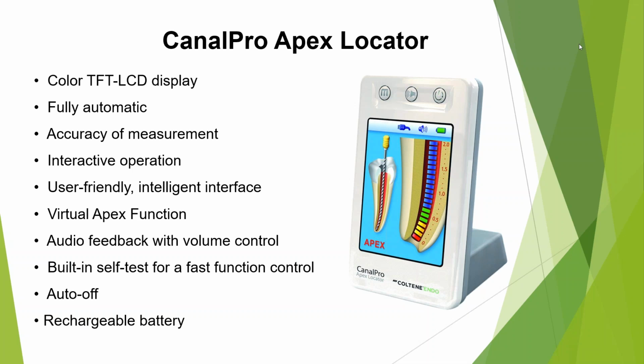Because what I was talking about in the field was there's the M button, and we can set that 0.5 millimeters shy of the apex, okay? But now it all makes more sense when we talk about the apical constrictor and the theoretical area and the foramen, yada, yada.